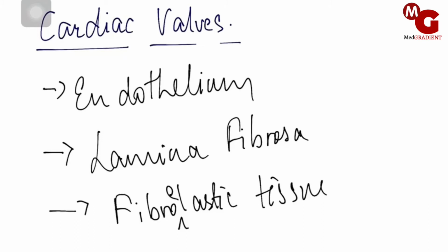So these cardiac valves have endothelium, lamina fibrosa, and fibroelastic tissue.